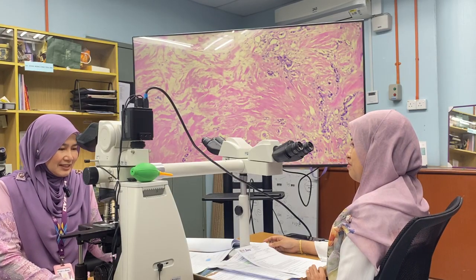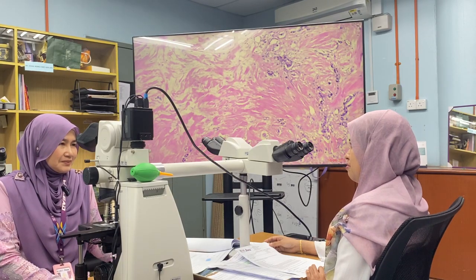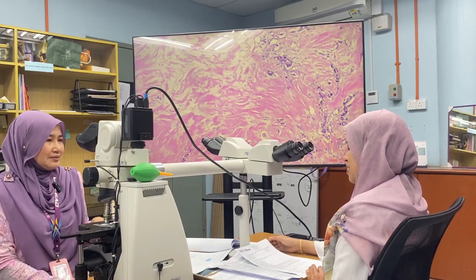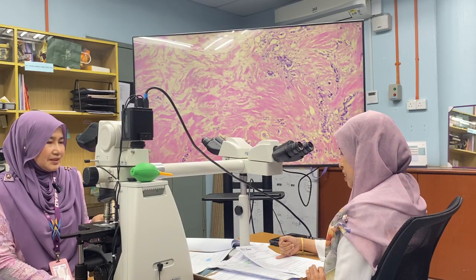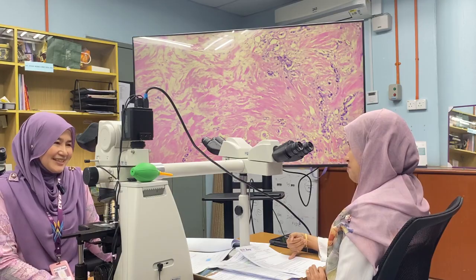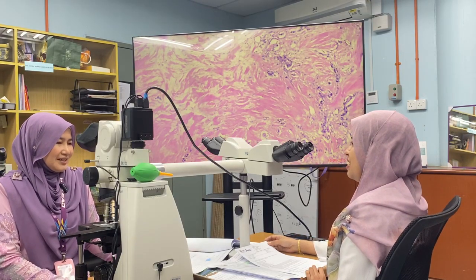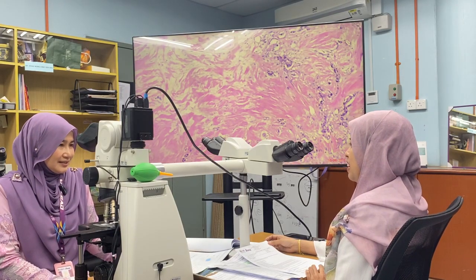Okay. And then what I think we better do for immunomarkers, since this patient is ER/PR positive, in a molecular subtyping, so it becomes what type? Luminal A or B? Because ER/PR positive is luminal A. HER2 also negative, so it's luminal B. Luminal A, sorry. This is luminal A. Okay. To confirm whether it is really luminal A or luminal B, yeah, we better proceed with that.